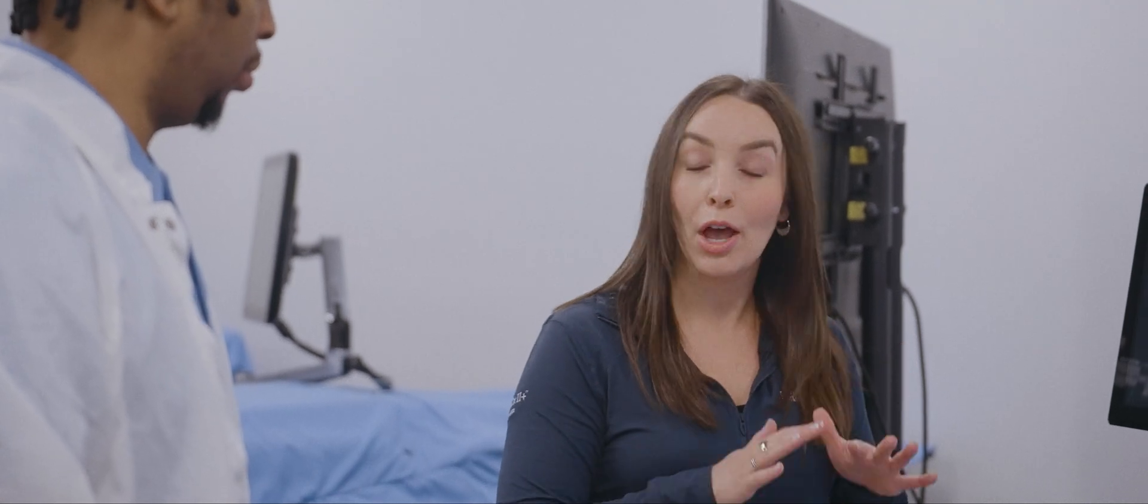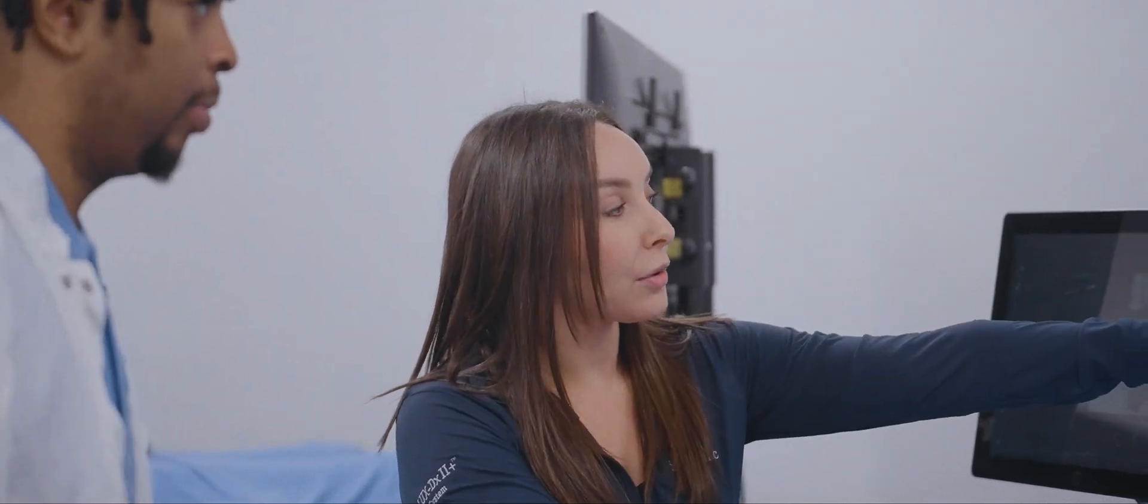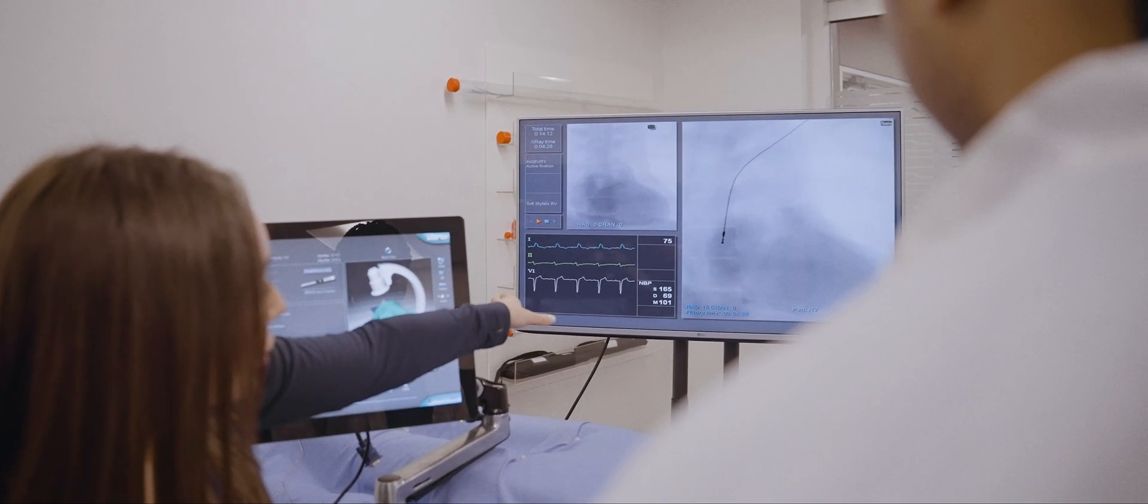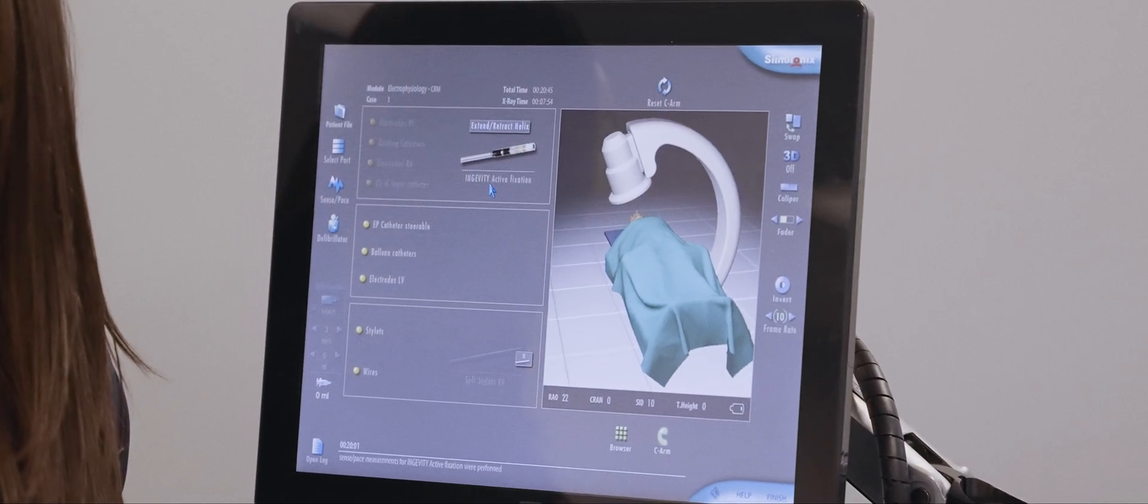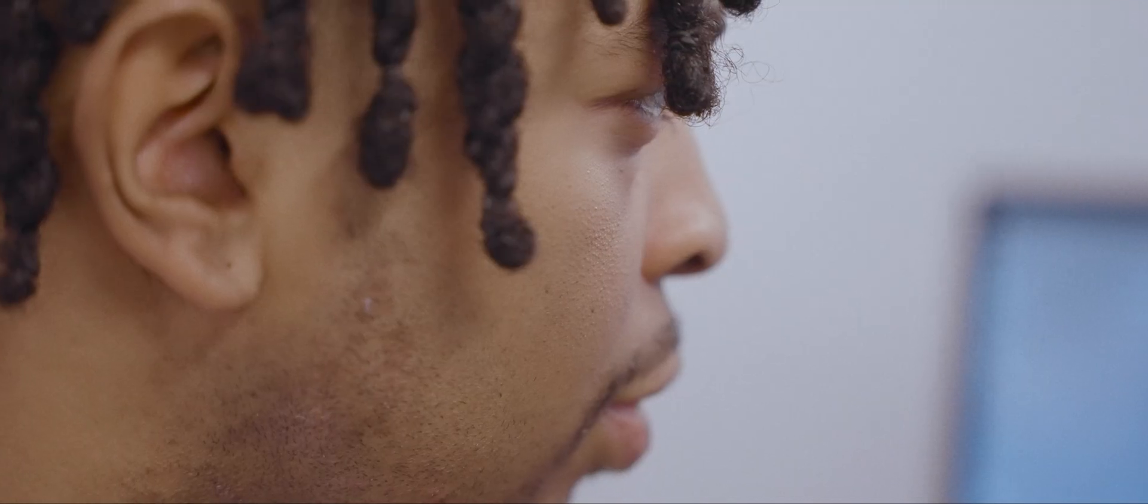Here's your patient, we're in the operating room. This is your monitor where you're going to see your x-ray, heart rhythm, and heart rate. And then on here is the controls where I can put our Boston Scientific products in the simulation for you to use. Let's do it. Okay, Dr. Juice is in the house.